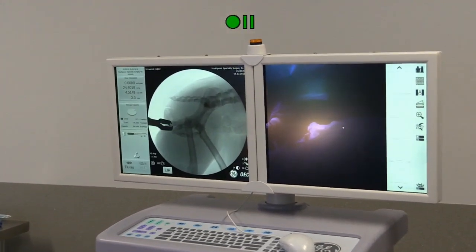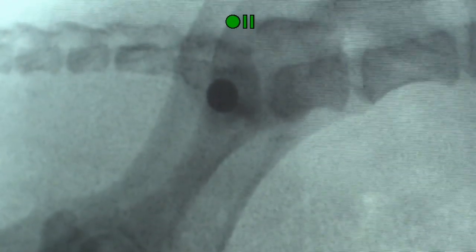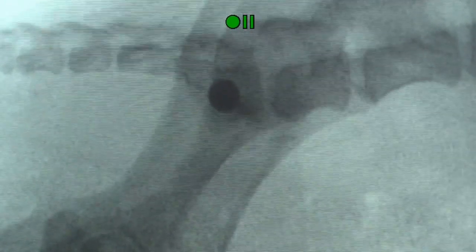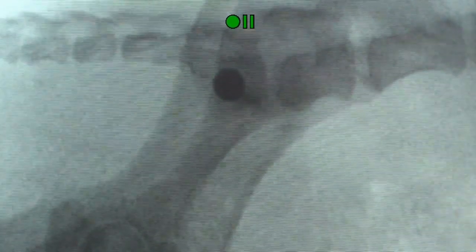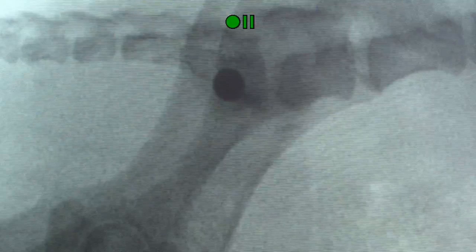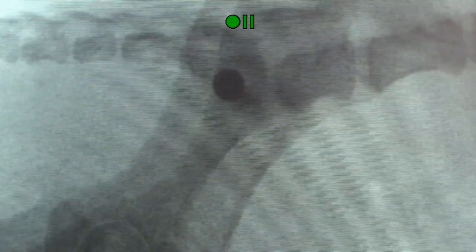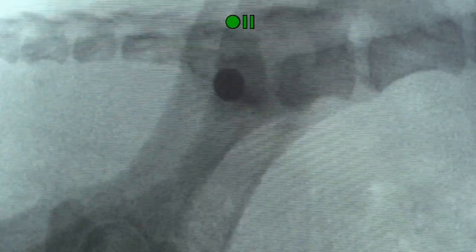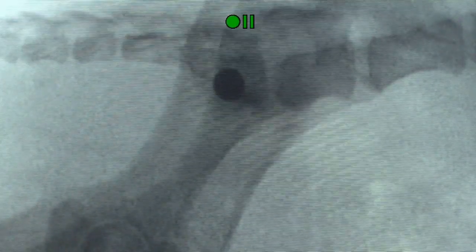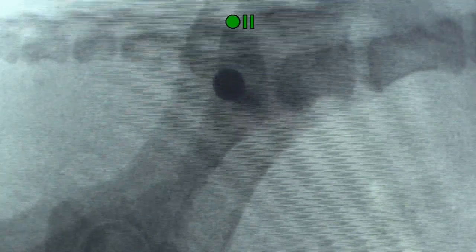Positioning it back looks really nice in a straight lateral view. Still have another look at that. So that's the positioning on the lateral view there. And you can see that it's dead center in the middle of S1. You really only have about a 7 millimeter square sweet spot when you're doing a sacroiliac luxation. And you can imagine that if you're doing this closed, or open without any imaging to help you, it would be easy to miss that sweet spot.